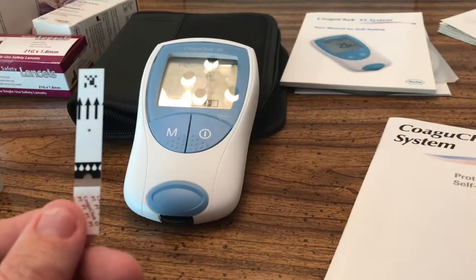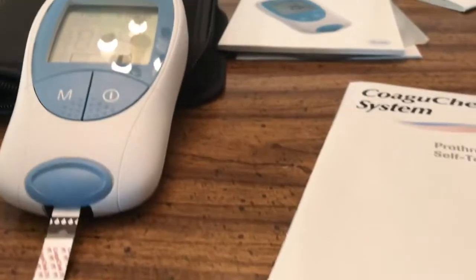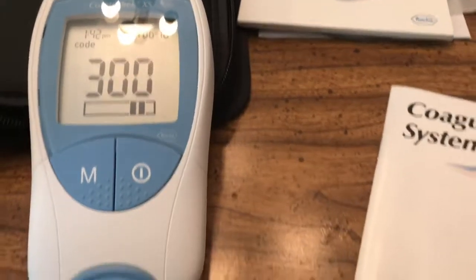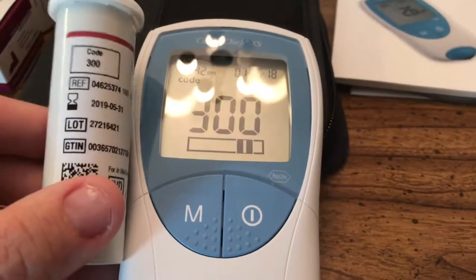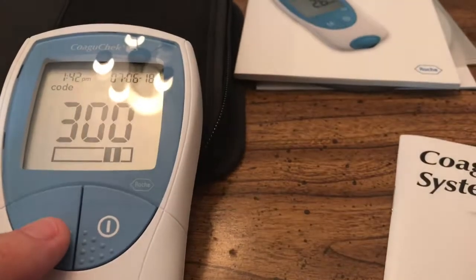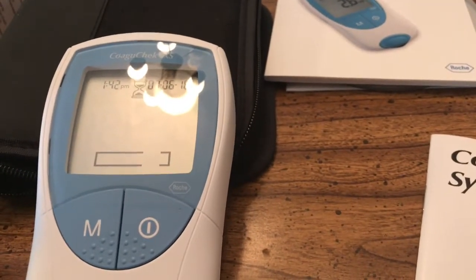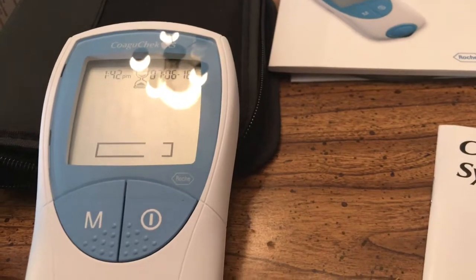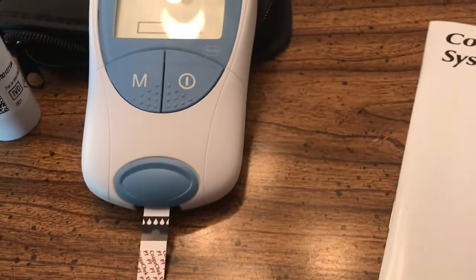This is what the strip looks like — it has an arrow identifying which way it needs to go in. This is face up and we're just going to slide this in until it beeps. We have the test strip in there; it's blinking 300, which is the correct lot number because it matches the code on the bottle. I'm going to push M for match. It gives me the hourglass and then it starts counting down, and during that time I need to go ahead and start pricking my finger and get the blood ready to put on the strip.